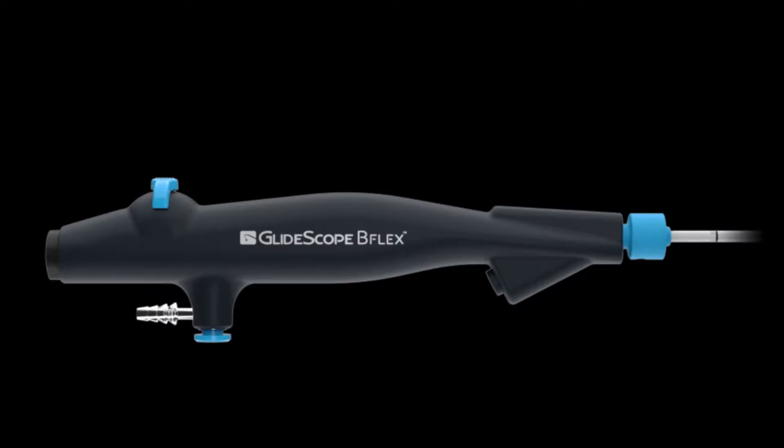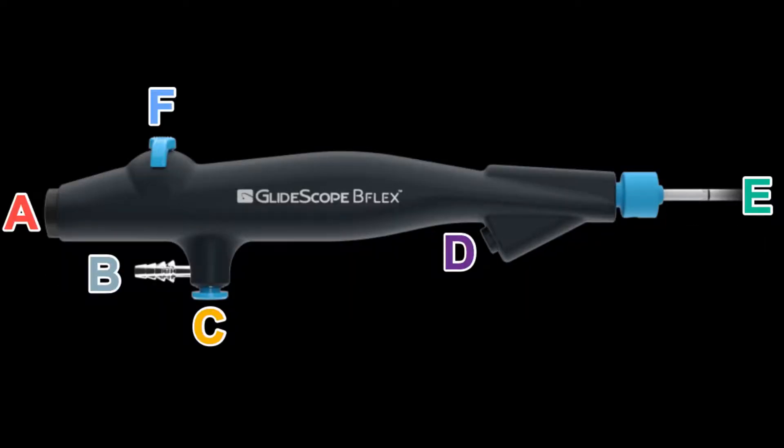Hello, this is Neil Dilworth, one of the emergency physicians from Georgetown Hospital, and today we're going to be doing an overview of the B-Flex disposable glidoscope, which will be an addition to our glidoscope in the emergency department for advanced airway procedures.